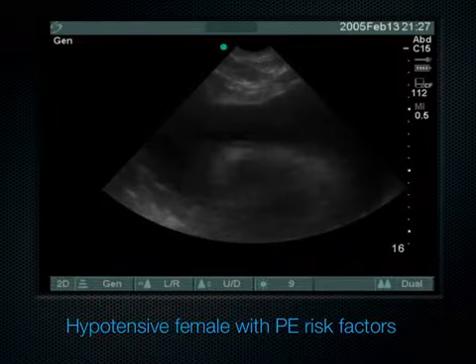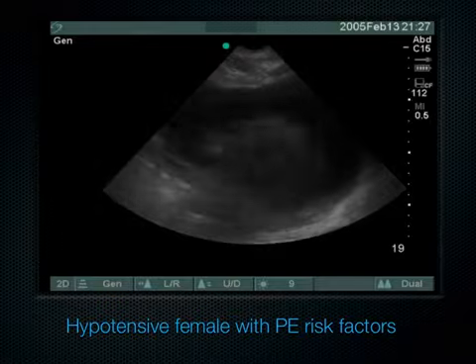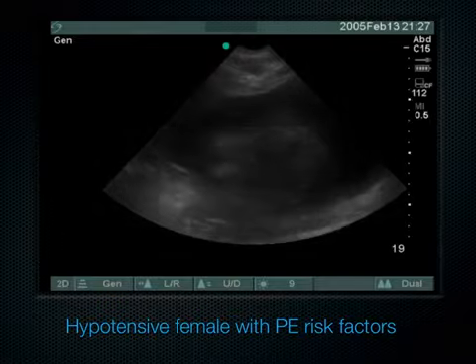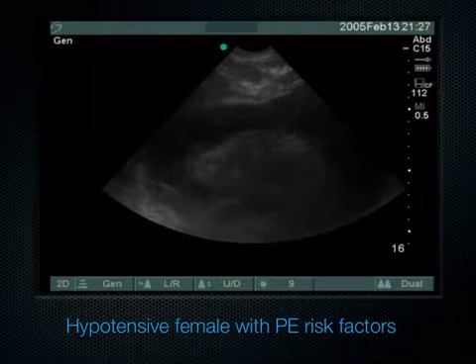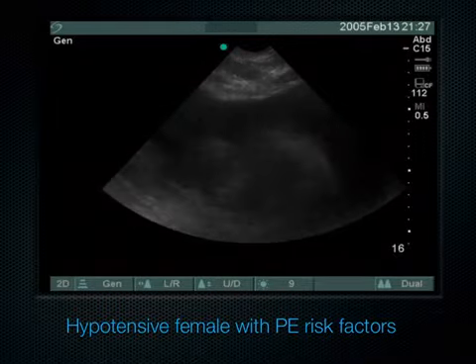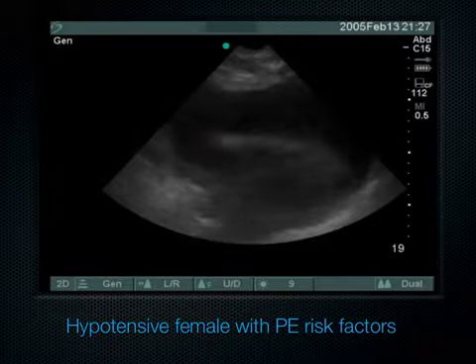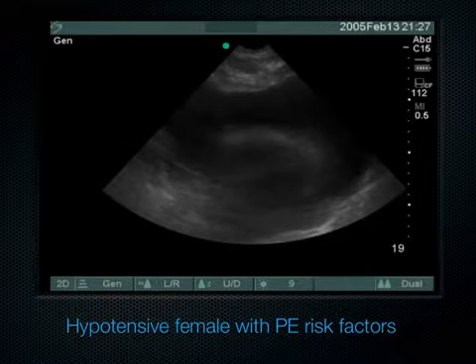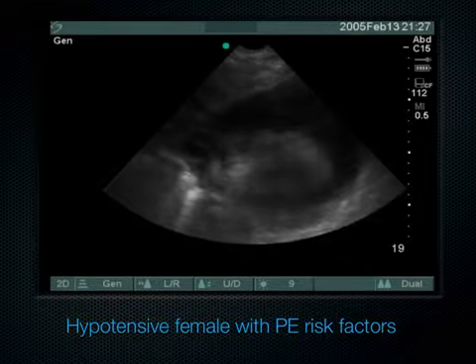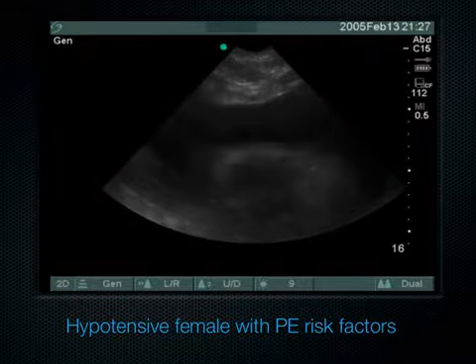Maybe it was just me being a poor clinician, not being able to figure out the difference between PE and tamponade on a hypotensive patient. Or maybe everybody would have struggled with that and been led down the wrong pathway. It really looked like PE to everybody in the room, but we were all wrong. The ultrasound really saved us from pushing thrombolytics, because then it would have been really difficult to do a pericardiocentesis on somebody we just gave thrombolytics to. We would have had a real problem with the reaccumulation and that kind of stuff.